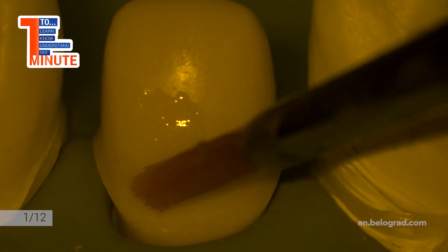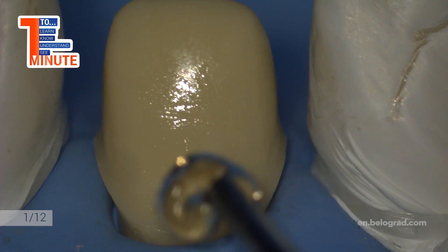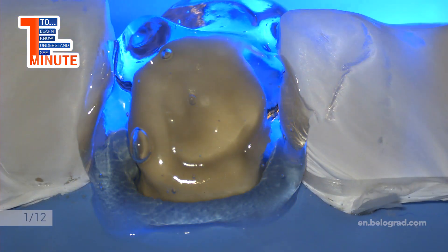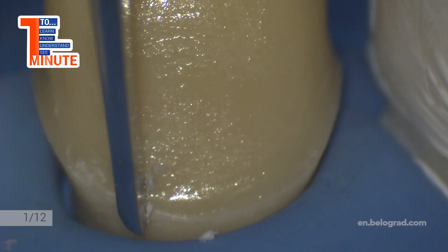Dent primer is applied for 20 seconds, activated by micro brush and dried. Adhesive is applied — we do this with a thin brush that helps us control excess and spread adhesive over the dentin surface precisely. Then 10 seconds light curing.